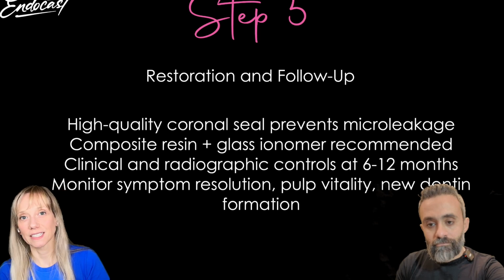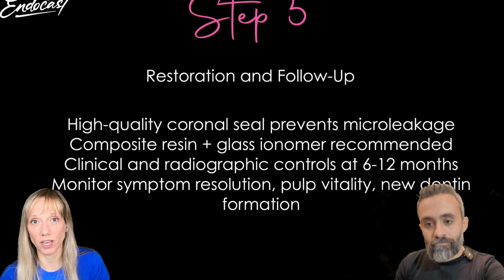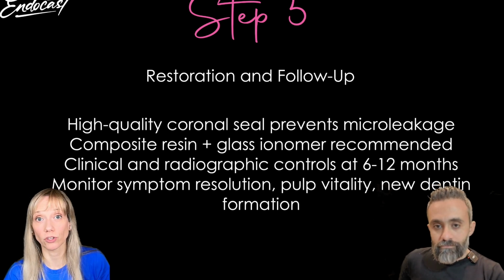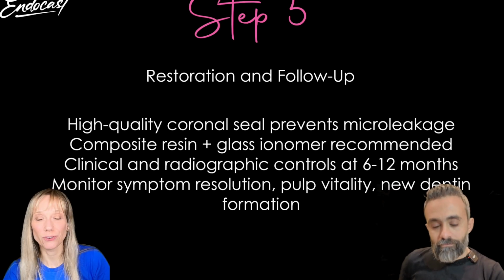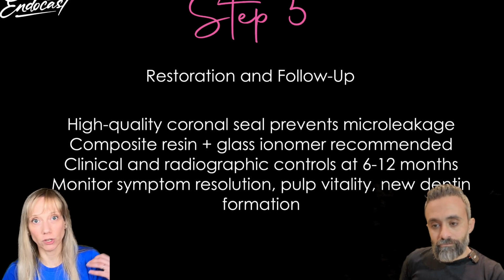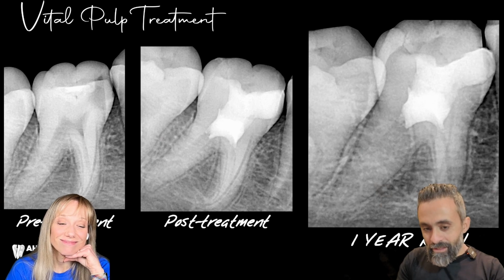And so 6 months, 12 months, and then on a yearly basis, or a 2 year basis, you can recall the patient and check. And of course you have to monitor the resolution of the symptoms, because in the first place you did the treatment because there were probably some symptoms, and you have to check the vitality of the pulp, the formation of new dentine, etc.